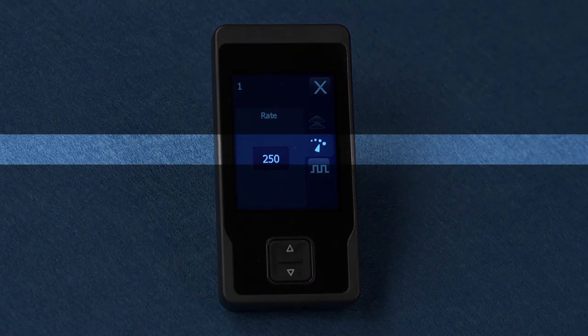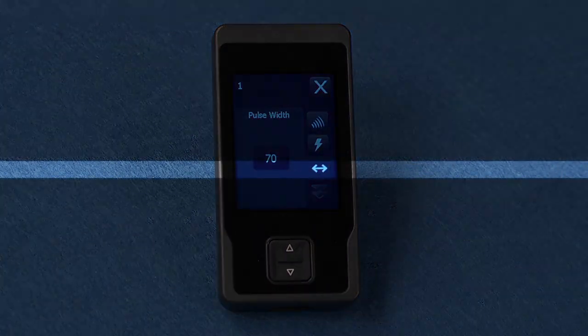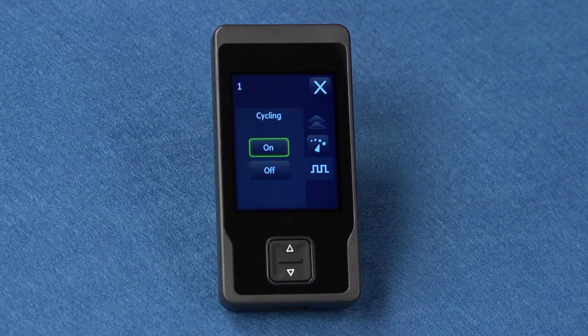This is the rate button. This sets the speed of stimulation. This is the pulse width icon. Pulse width sets the length of the stimulation pulse, which affects the strength and coverage area of stimulation. This is the cycling icon. It turns stimulation on or off at regular intervals as programmed by your clinician.